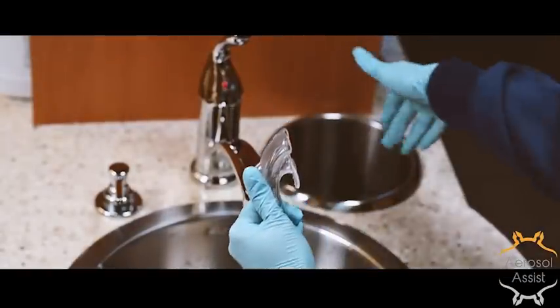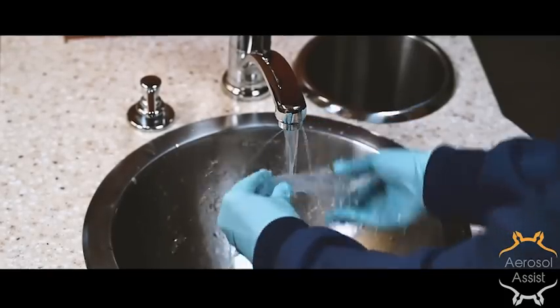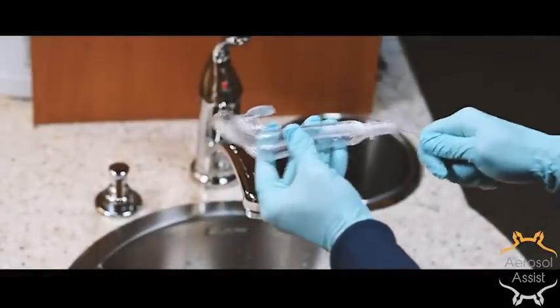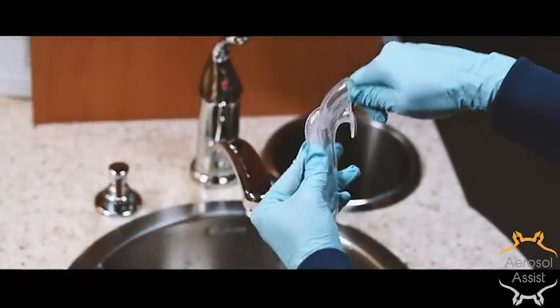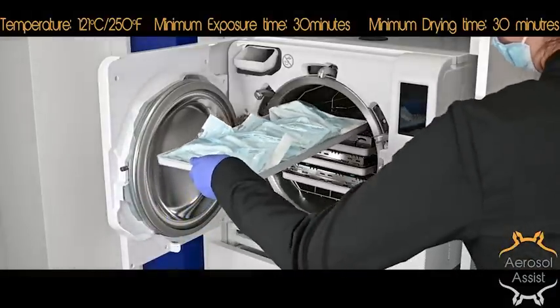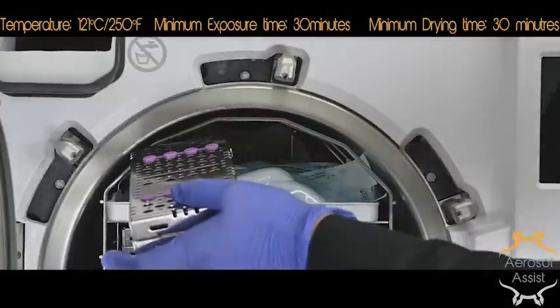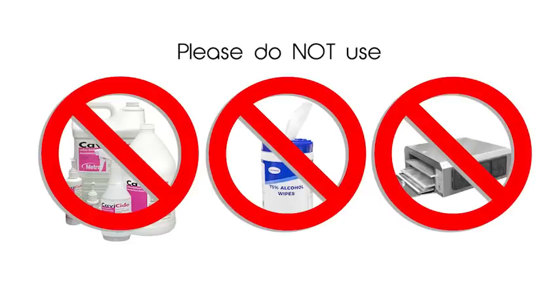After each use, the saliva ejector is discarded. The aerosol assist is then rinsed internally and externally to flush out any debris. The HVE port has two internal channels that can be cleaned with a standard brush. The aerosol port has access to those same channels and should be cleaned as well. After rinsing, they can be ultrasonically cleaned in an enzymatic bath and then placed in standard sterilization pouches. Load them single file on the autoclave tray and insert the tray in the top slot only. It is important not to place any other instruments or trays on top, as this may warp the device. Do not wipe it down with alcohol, Caviwipes, nor dry it in an instrument dryer prior to placing it in the autoclave.